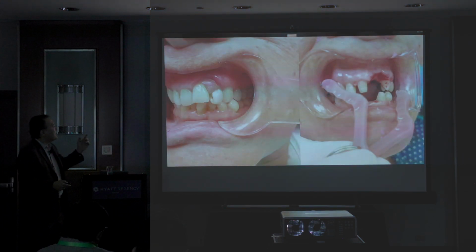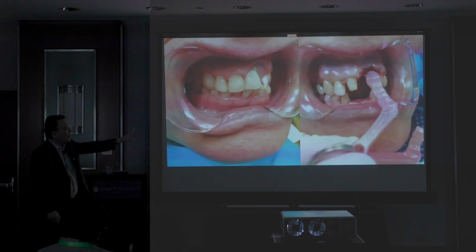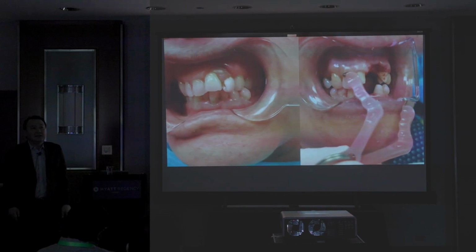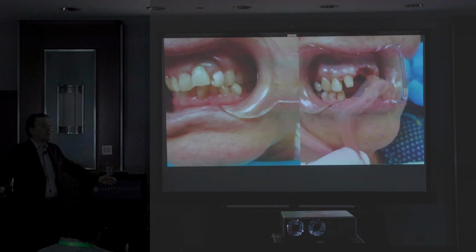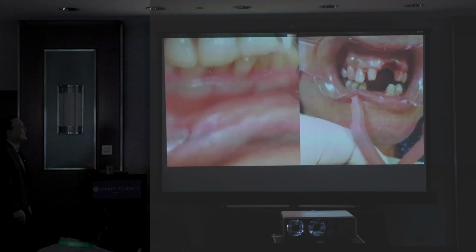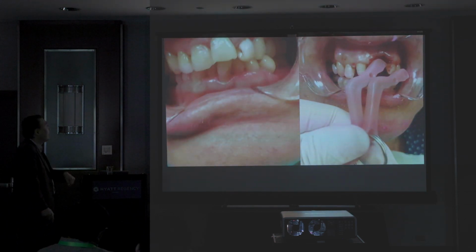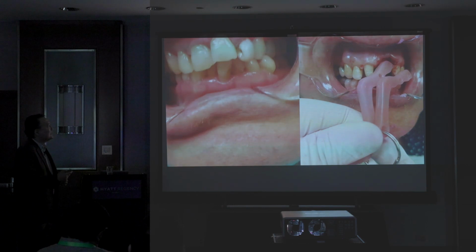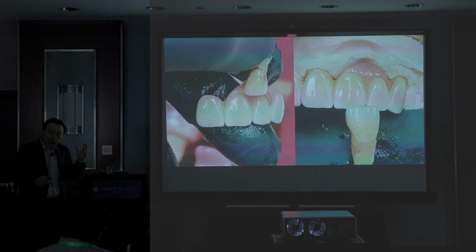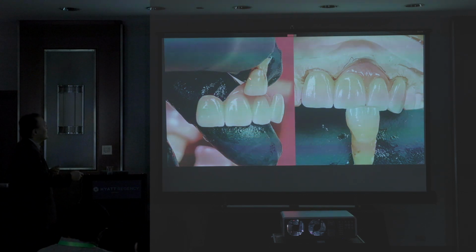The important thing is the texture, which is from Dr. Peter Abdur from New Jersey, and the great information. They pulled out the teeth before, after prepping the teeth. Wow, right? I love it. I love this video. I told them it was a great job. So they check the pink color. And the natural teeth. So pulled out the teeth, right? Before you saw that. So he sent me this, which is, I love it.